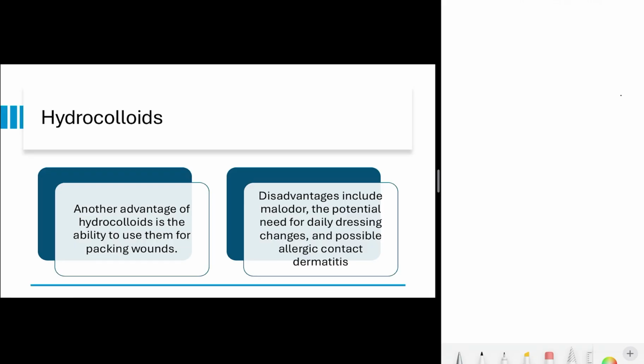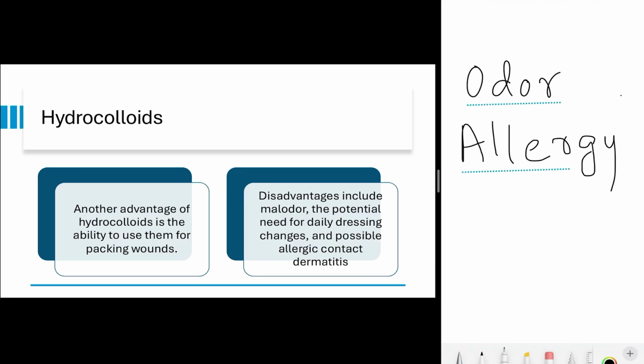Then again, another advantage of the hydrocolloids is the ability to use them for packing wounds. So what are some of the disadvantages? The disadvantages include it might have a bad smell, potential need for daily dressing changes, and the possibility for allergic contact dermatitis. So these are some of the disadvantages of hydrocolloids.